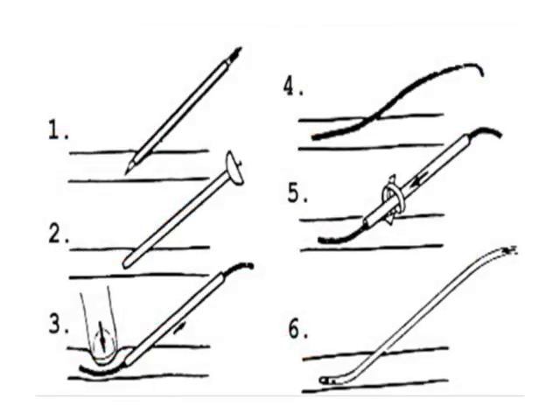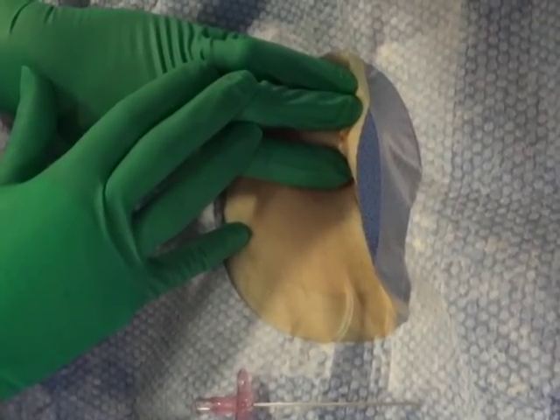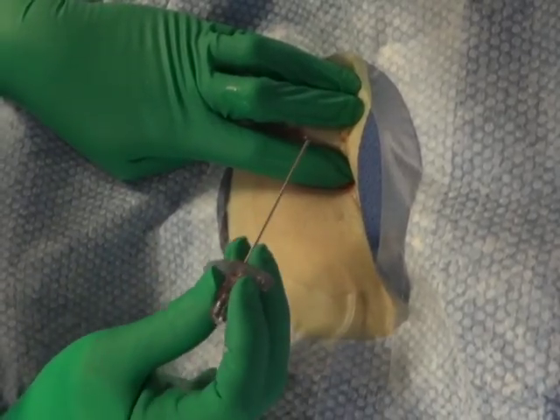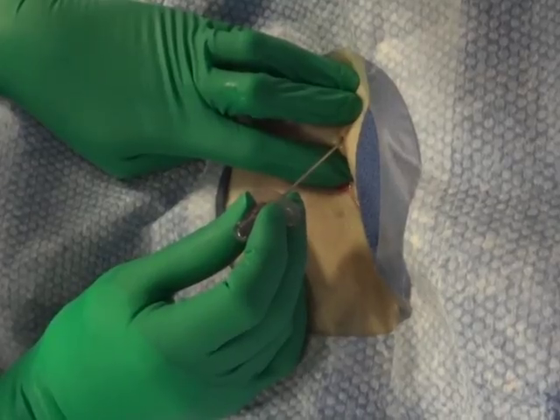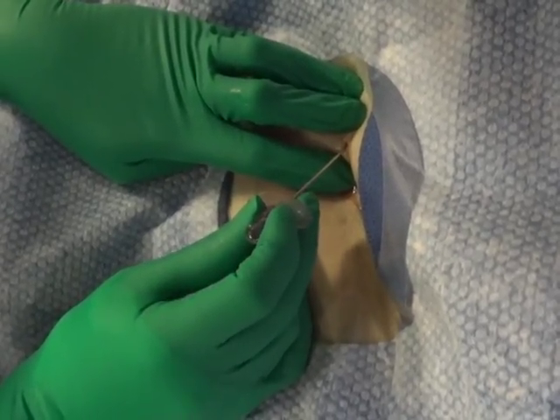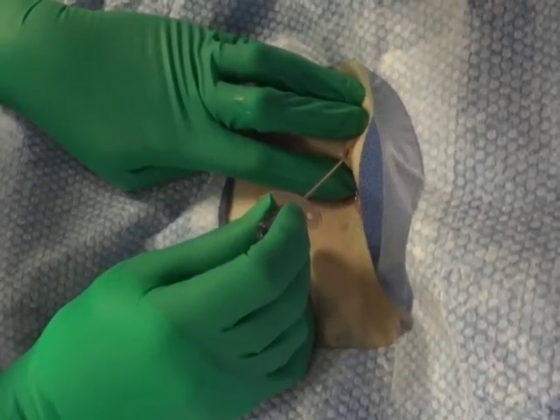Single wall puncture should be done for anticoagulated patients to minimize risk of bleeding. Only the anterior wall is punctured. Here a single wall puncture is performed. Insert the needle at a 45-degree angle with the bevel facing up. Advance slowly through the skin and subcutaneous tissue. When you have reached the artery, you will feel a pulsatile sensation through the needle. Continue by applying firm but gentle pressure to the needle until you see pulsatile blood return.